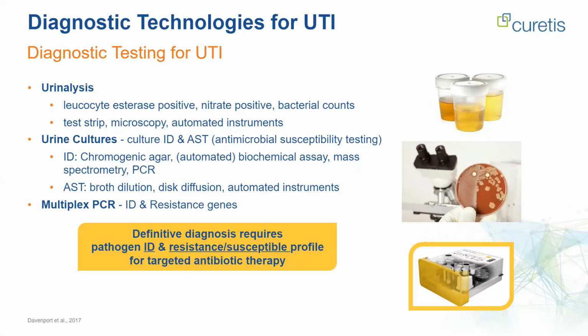Therefore, in many healthcare settings, urine dipstick testing is no longer performed at the point of care. Instead, urinalysis is done in the clinical laboratory using a microscope and some automated instrument, such as flow cytometry, urine sediment analyzer. A positive urine culture is defined as 10 to the power 5 colony-forming units of microorganisms per milliliter of urine.